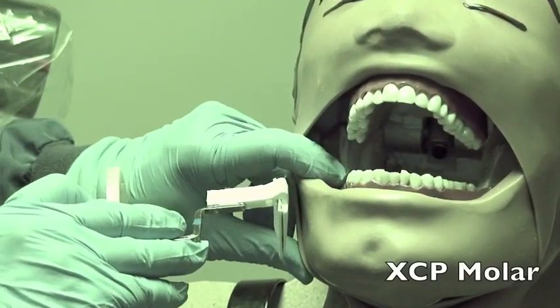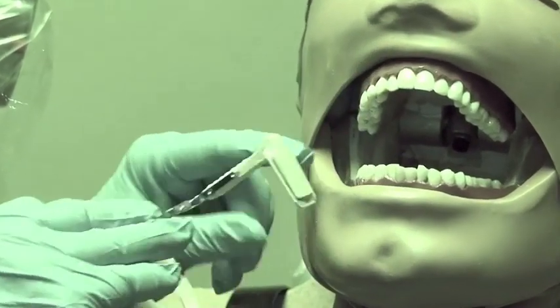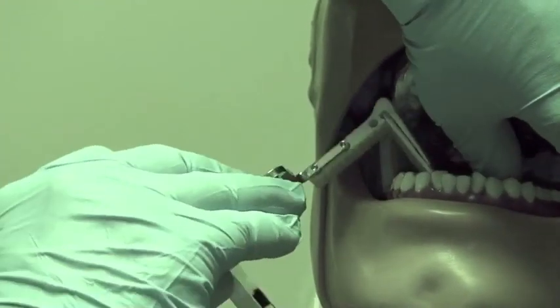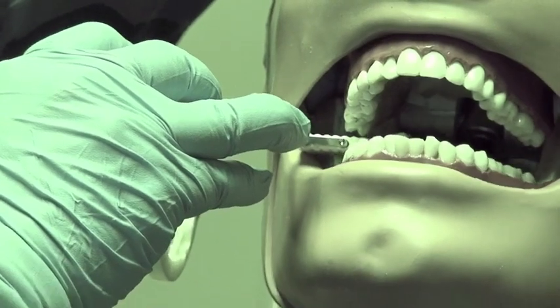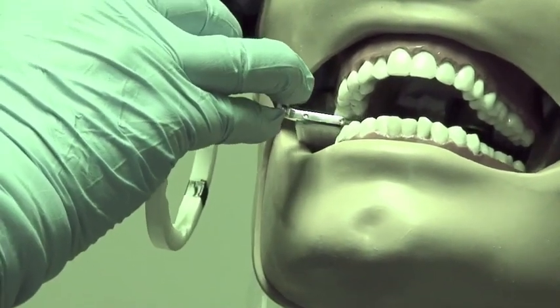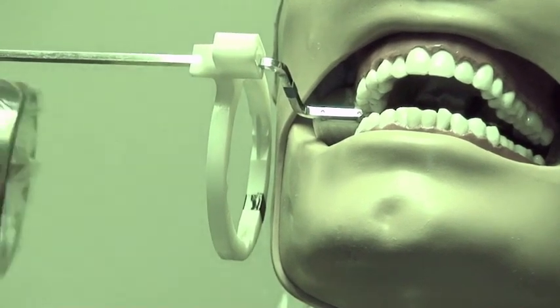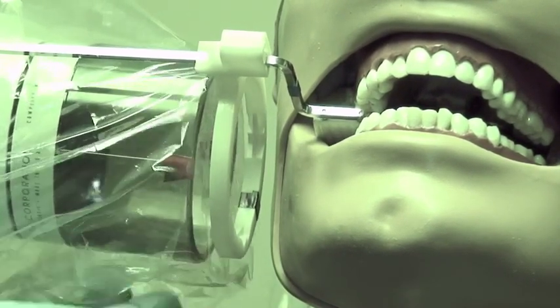On the molar view, the objective of this technique is to get the apices of the teeth. Push the film back a little bit in the holder so that the mesial of the film is at the mesial of the six-year molar. That way you will get the apex of the last erupted molar. Then line this up parallel to the ring.